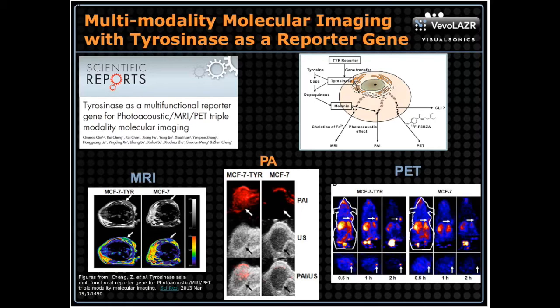The MRI uses the ability of the melanin to carry iron, and for PET, a different melanin-specific contrast agent was injected to be able to detect it. Again, photoacoustics allowed you to image expression of tyrosinase over time in a continuous study, in case you have a condition knock-in, knock-out. PET required a longer imaging session. It's indicated here by the 2 hours from time of injection, to allow clearance and see the accumulation by detecting the tyrosinase.